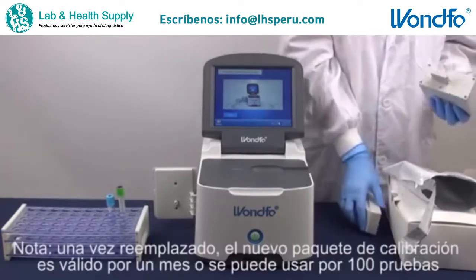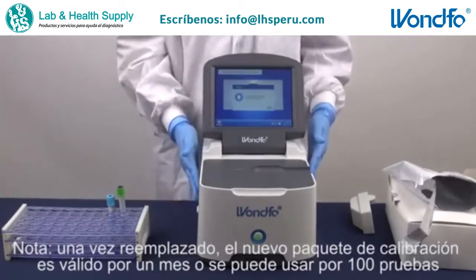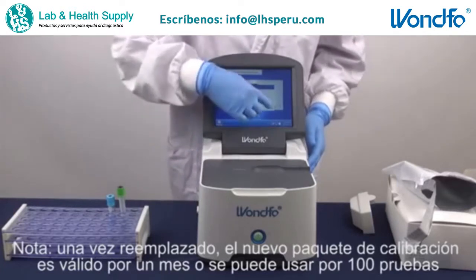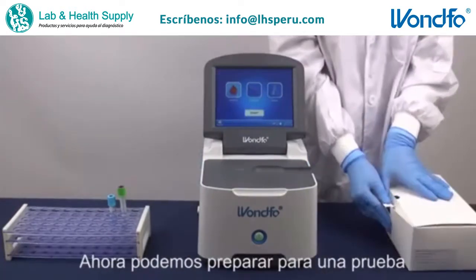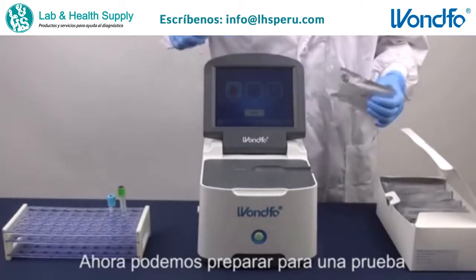Note: once replaced, the brand new calibration solution is valid for a month or can be used for a hundred tests. After replacing the calibration solution, we can prepare for a test.